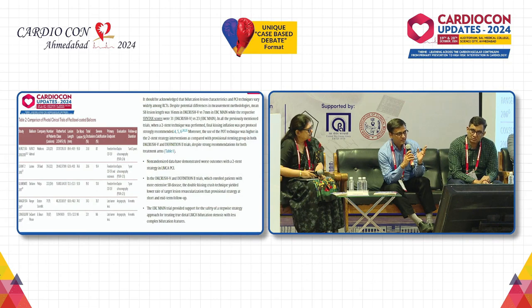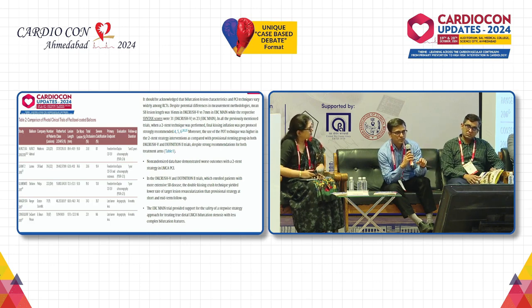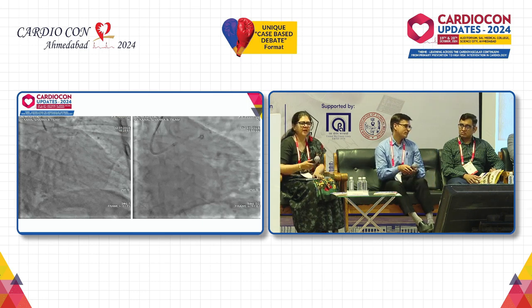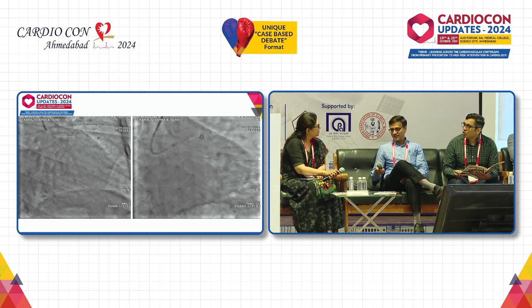And therefore, imaging will give you a lot of insights into predicting what is going to happen to that patient. So I believe there is definitely a role of treating focal lesions with a cutting balloon, then using a drug-coated balloon and leaving it there, adhering to the single stent strategy. That may be a good outcome. One correction I would like to make.